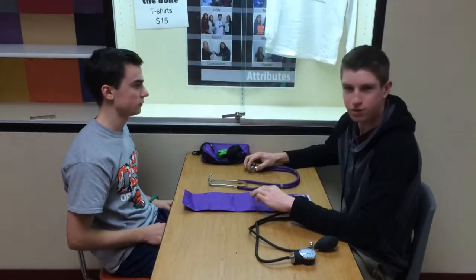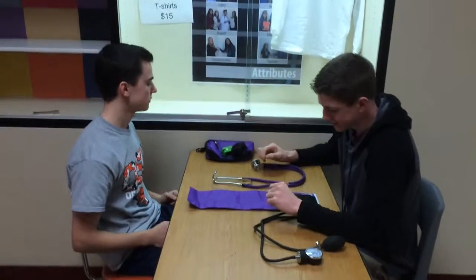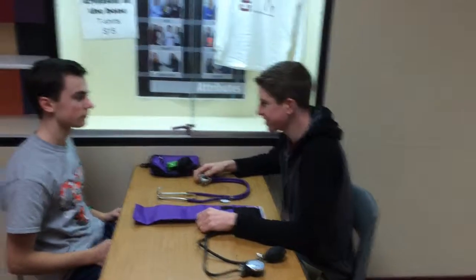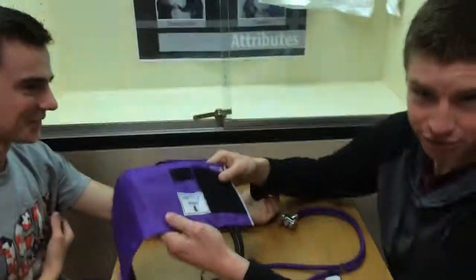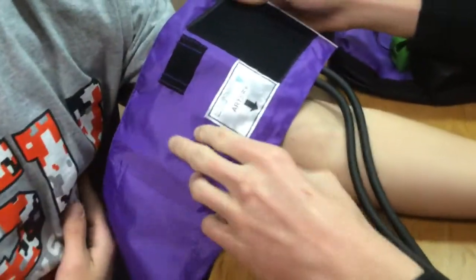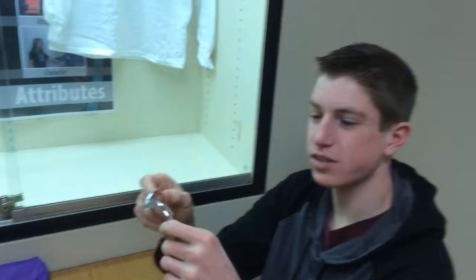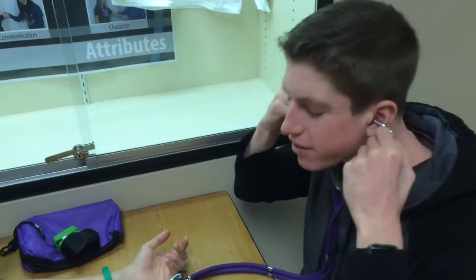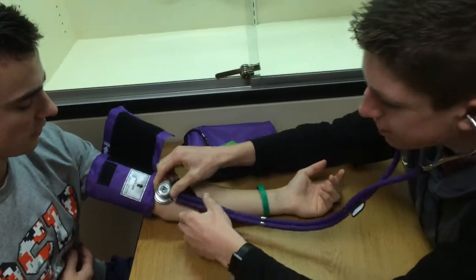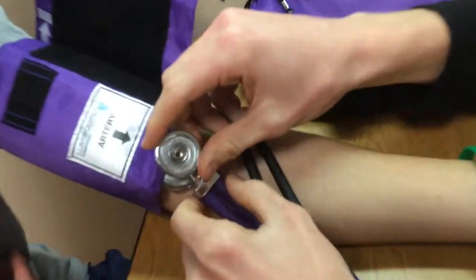You have to take the proper blood pressure of a patient here on Garrett. First, we need to get his arm up here on the table and find his brachial artery, which is located on his arm, on the bicep. Then you take the blood pressure cuff, place the artery arrow on the artery, and then wrap it around and put on the stethoscope. Place it in your ears with these facing forward, and place this part underneath the cuff below the artery arrow.